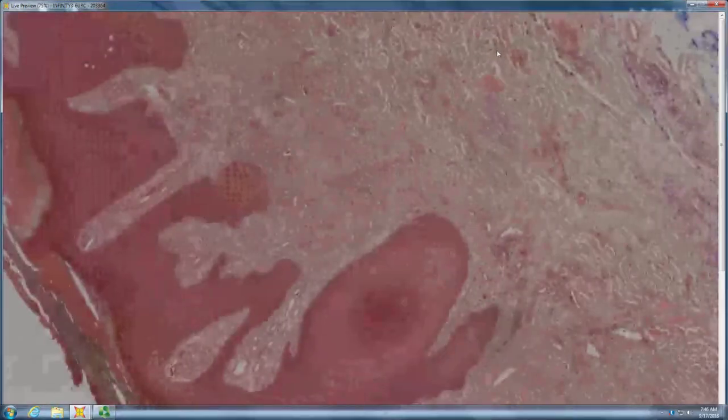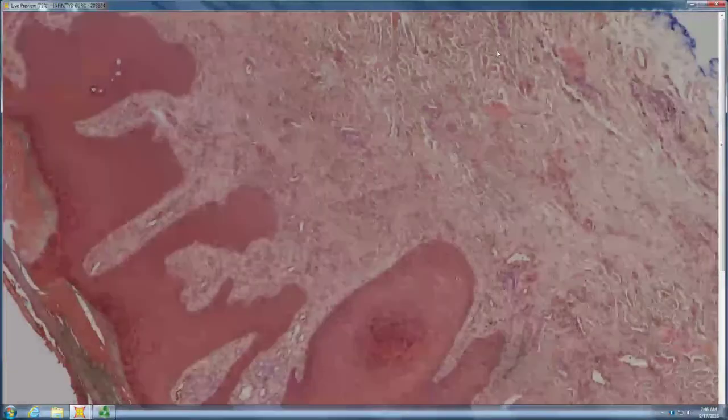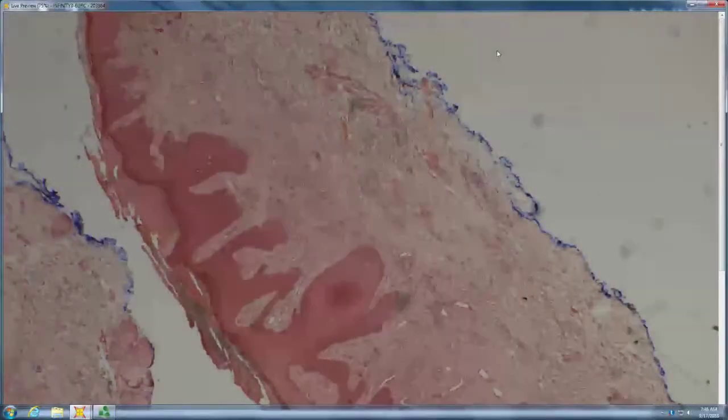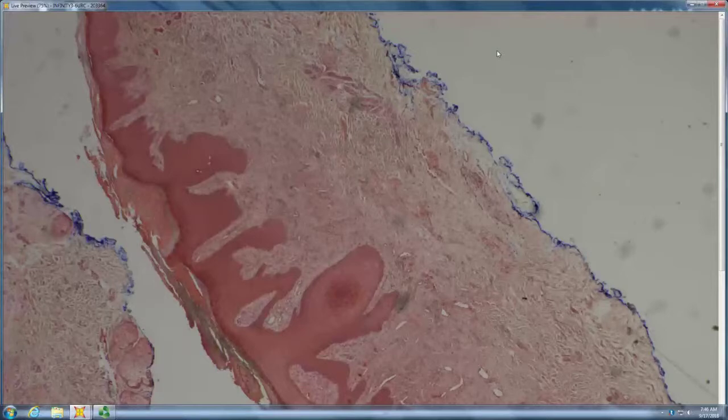I think I'll take this one. Again, some hyperkeratosis. There's some neutrophils in the horn there, I feel like. So some neutrophils in the horn, but I don't feel like it's very psoriasiform. So when you say it's looking at LSA, or LSC rather. LSC, exactly. So this is crusted LSC. So not everything with neutrophils in the horn is psoriasis. You know, this is probably just a little impetiginized prurigo.